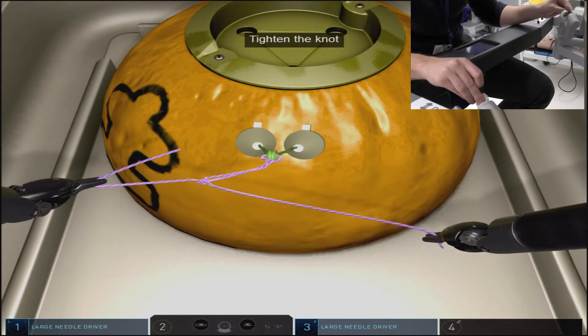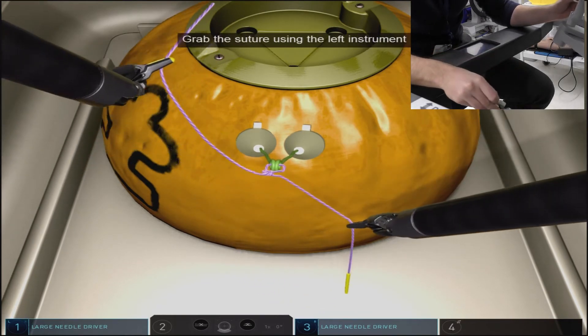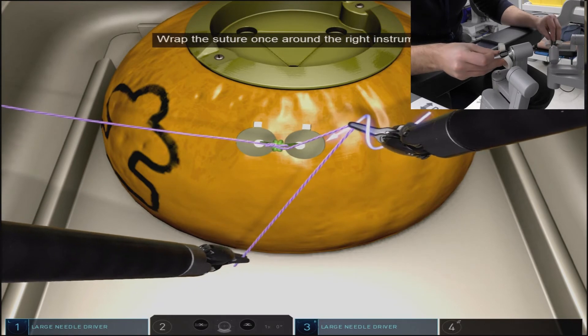As you'll see, we'll actually pull up vertically on one of the ties, which not only allows us to complete our knot efficiently but also places that end in a good position to grab for the next throw.